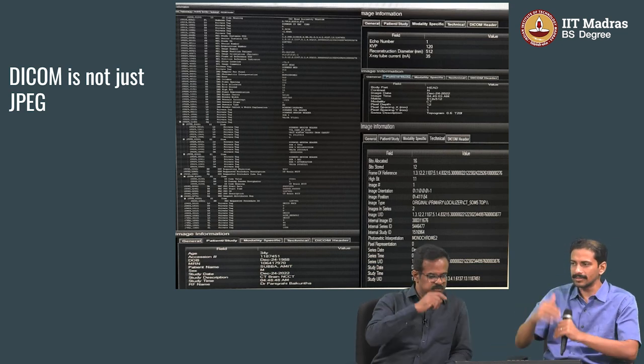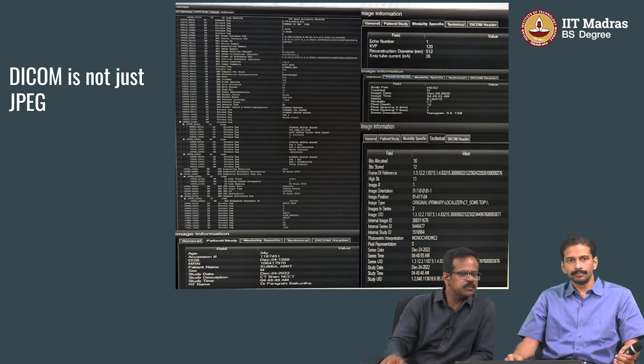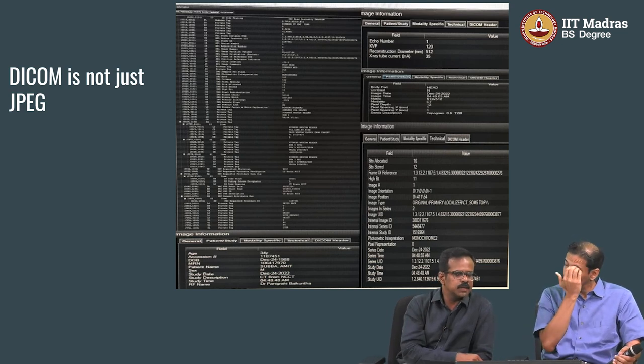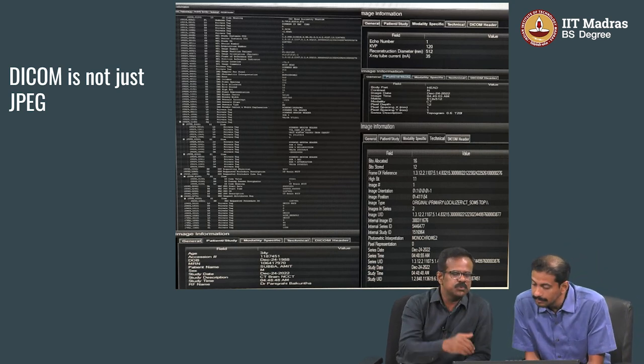So it varies. This is the metadata with each image, an example from one patient. This is the DICOM header. Metadata means all the other associated information, as explained, including the age of the patient, when the scan was taken, and the positional information.